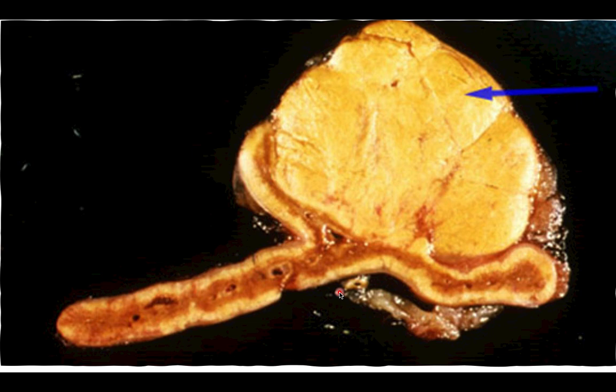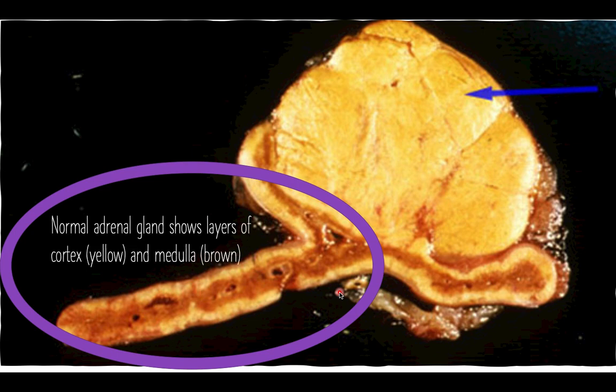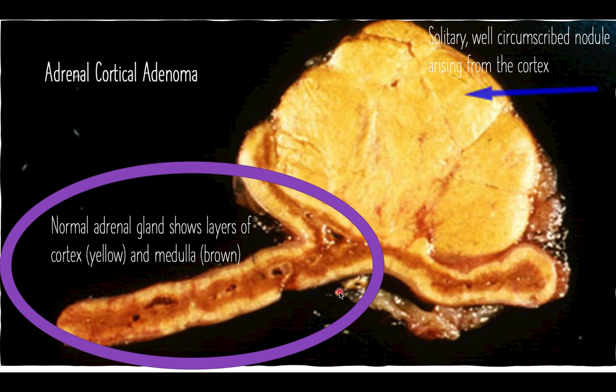Let's move on to the next organ, which is the adrenal gland. This is a typical gross image of an adrenal cortical adenoma.